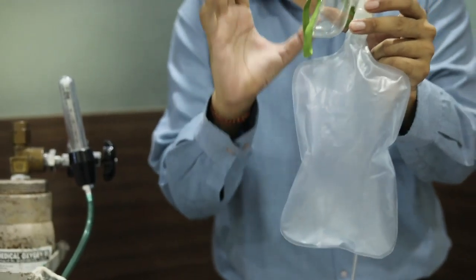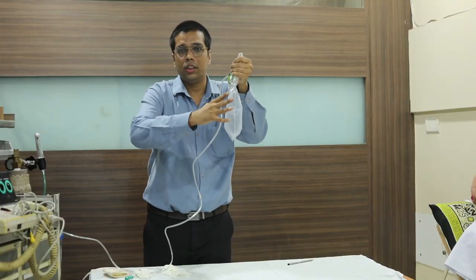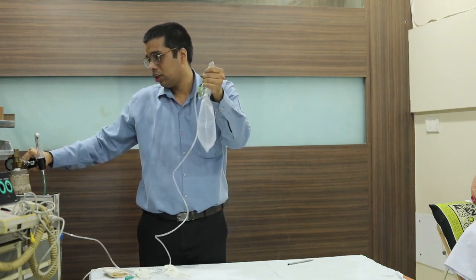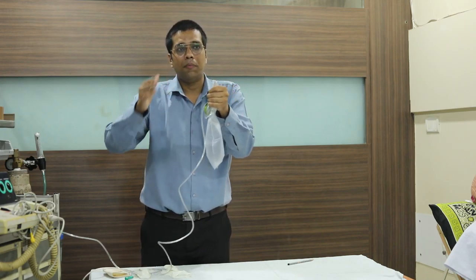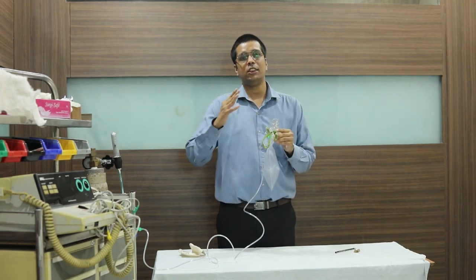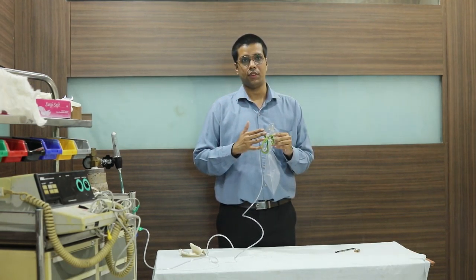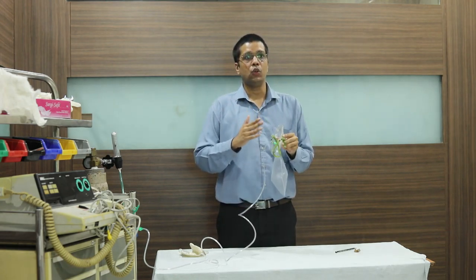All the oxygen is going to be accumulated in the oxygen reservoir in the bag. I have set the flow to 12 litres. This 12 litres is going to be delivered to the patient. Never dispense oxygen at less than 12 litres. The mask is not intended to function with a lower flow of oxygen.